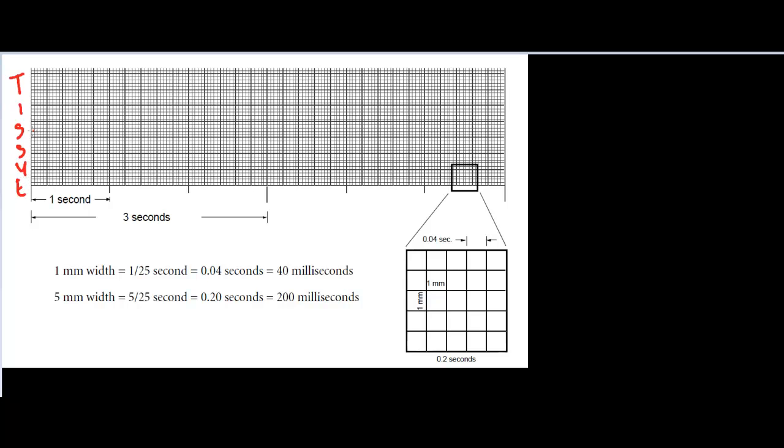So if we had an event going along like this, we have one like this and one like this, we'd look at this and we'd say there's a lot more tissue involved here than here. Relative to each other, this one is a smaller event than this one. This one is looking very atrial. It looks like that's probably an atrial event. And this one, I'm just going to abbreviate. This one looks ventricular.